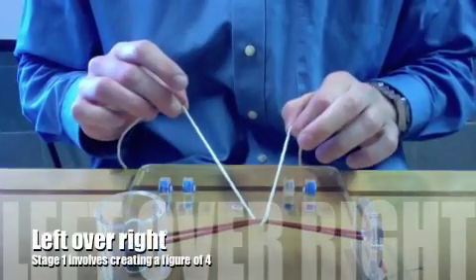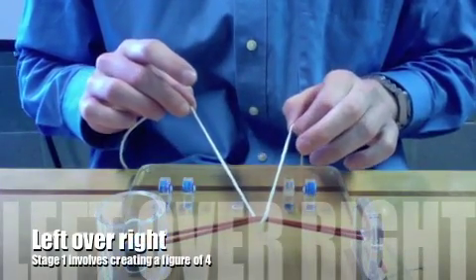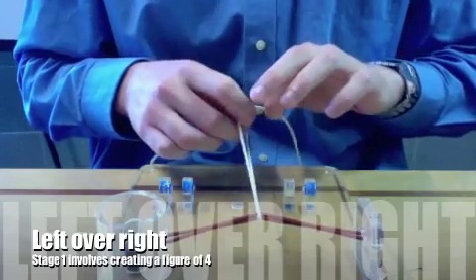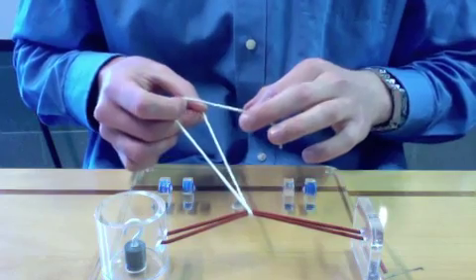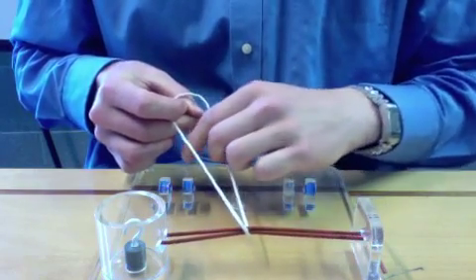The first stage is left over right. I hook the left string with the index finger of my right hand and this makes a figure of 4 facing me. I then loop the left string under and tighten the string.